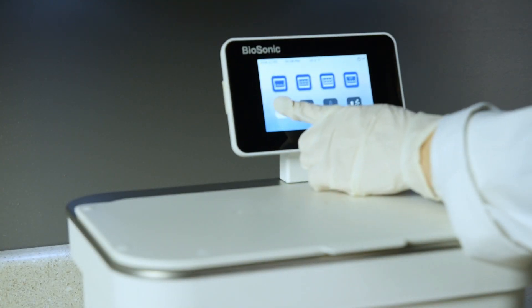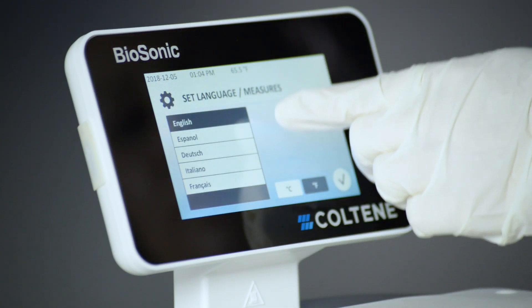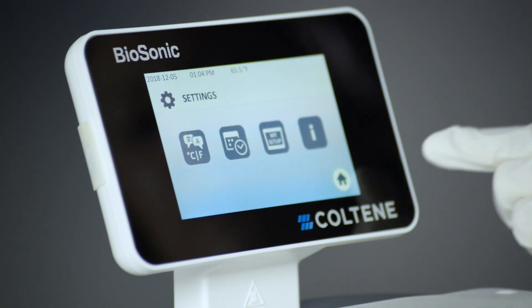On power-up, select your language from the drop-down list on screen, then select Celsius or Fahrenheit with the format buttons. Press the checkmark button to accept.